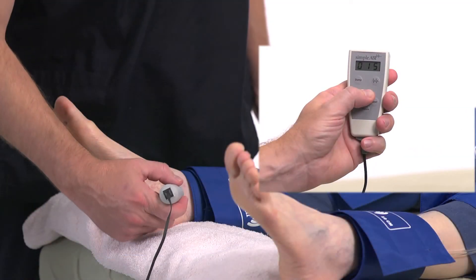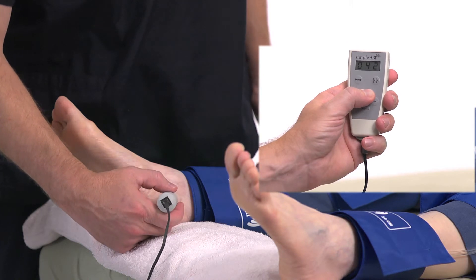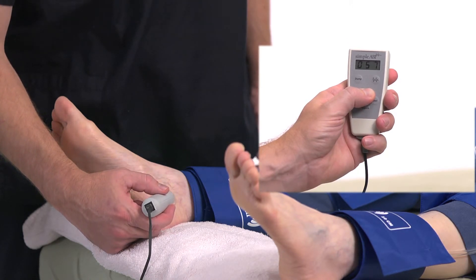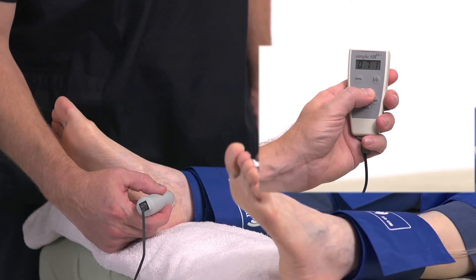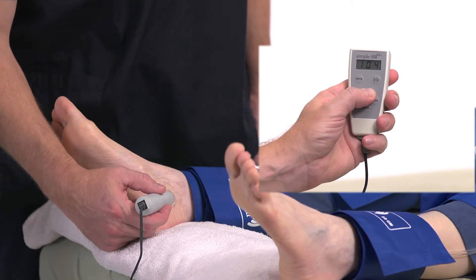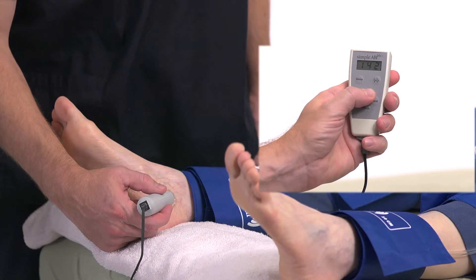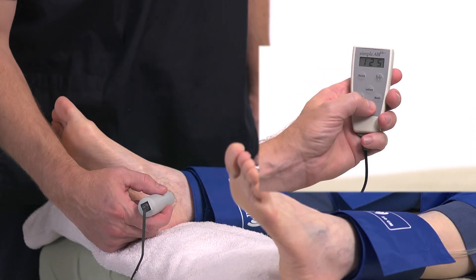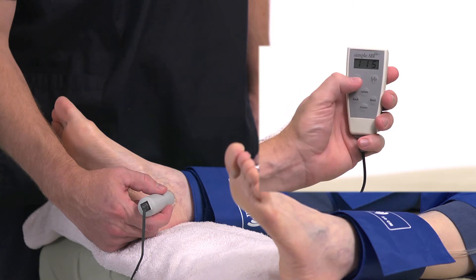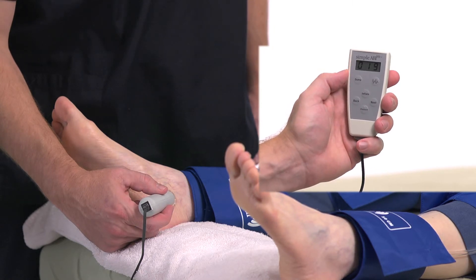Perform an ABI as discussed in the previous section on the ABI test. For this test, the ankle pressure needs to be done using only one artery — use whichever one is easier to find and maintain. No PVR waveforms need to be taken. Following the resting test, the patient is screened for contraindications. If the patient has no contraindications, you may proceed.